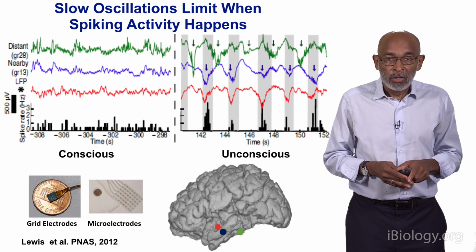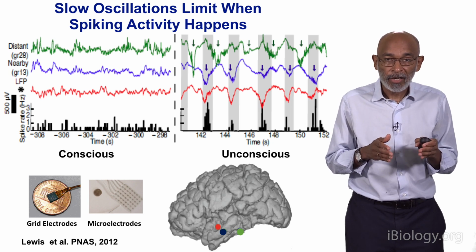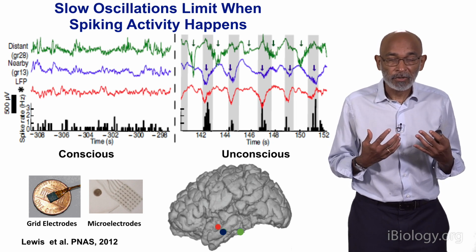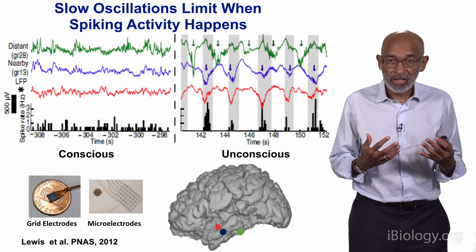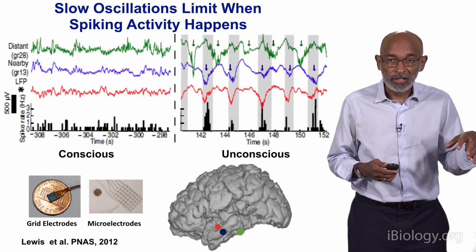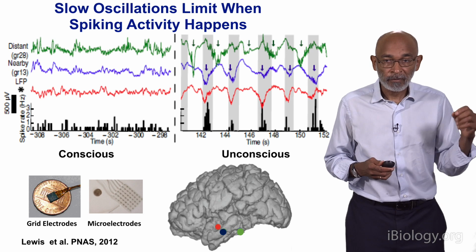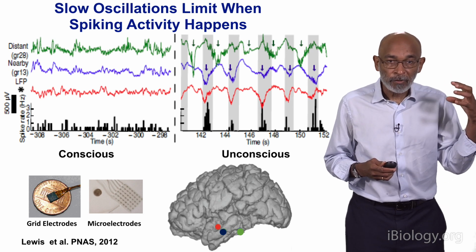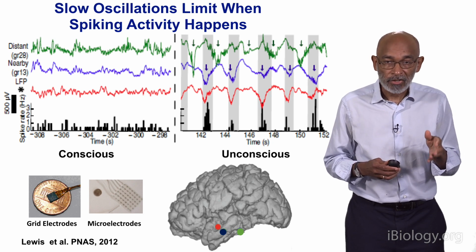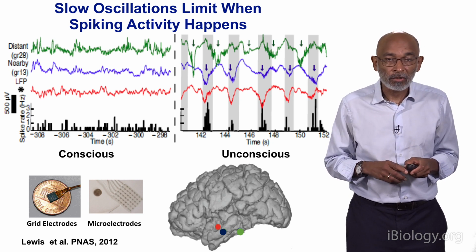All right? So when a patient comes back to the operating room a second time to have the electrodes removed, we have a natural experiment from an anesthesia standpoint because the person has to receive general anesthesia to have the electrodes removed. So what we do is we just record the neural activity to try to learn what happens when you give someone anesthesia, recording not from the scalp now, but directly from the brain. So these were some very, very insightful studies. It was the PhD thesis of one of my graduate students, Laura Lewis.